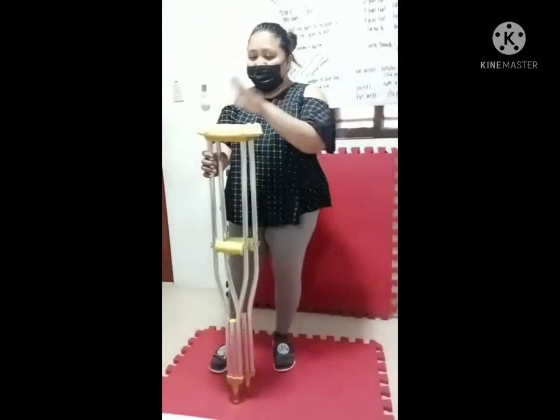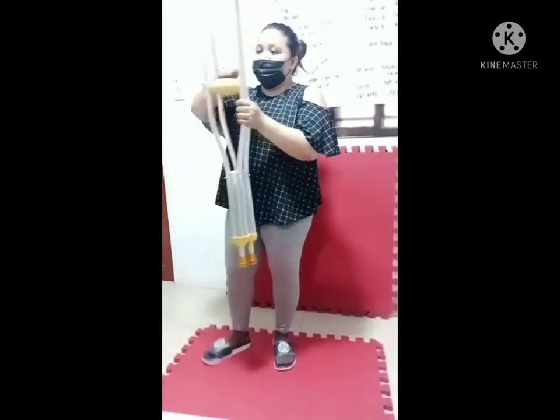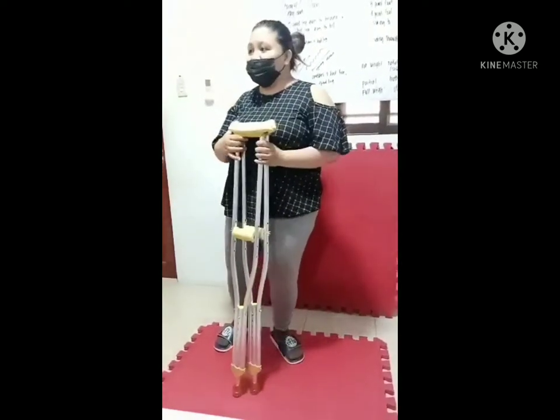These are the parts of the crutches. We have the crutch top, the hand grip, hand grip adjustment area, crutch length adjustment area, and the crutch tip. We assist the patient into a standing position.